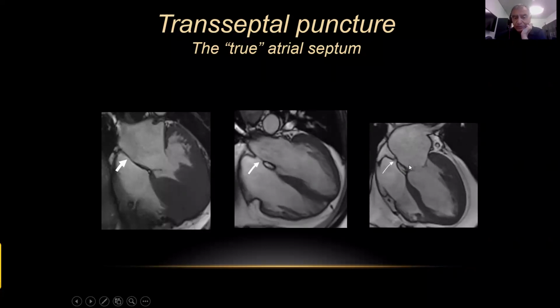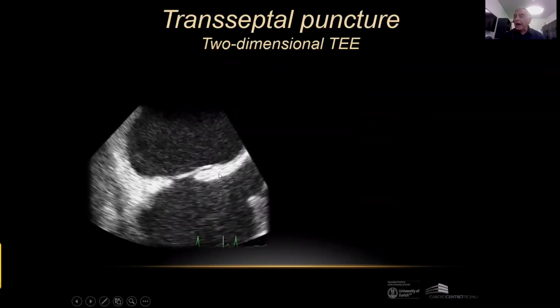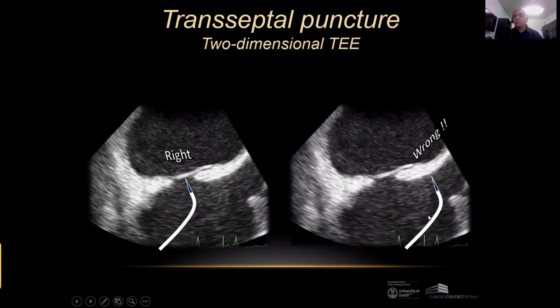So this is important, because the puncture of the interatrial septum has to be made in the fossa ovale, which could be large, like in these cases, or medium size, or even small size. So, in other words, this is right and this is wrong.